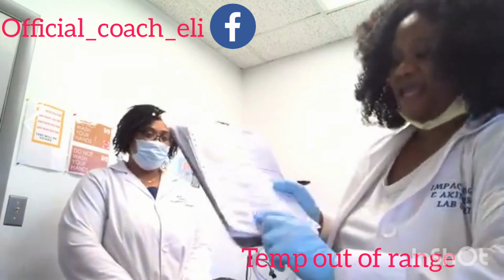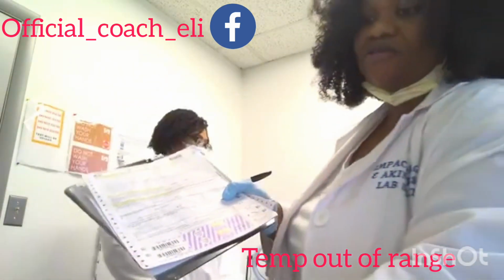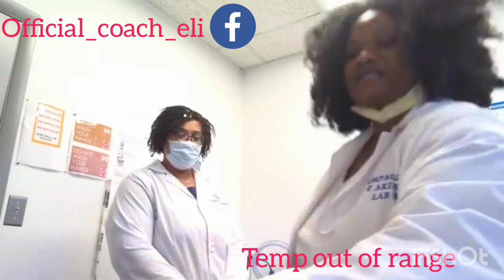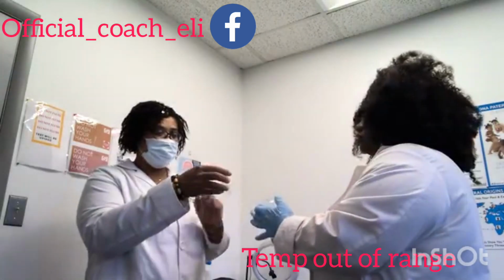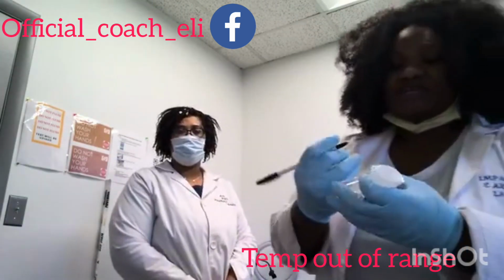I'm going to take this A label, all right, this guy right here. I'm going to put A on 30. I'm going to put 15 on B. Once I do that, I'm going to ask my collector, my donor, could you please sign, initial? Thank you. Initial. All right, she's initialed, and I'm gonna go ahead and date.